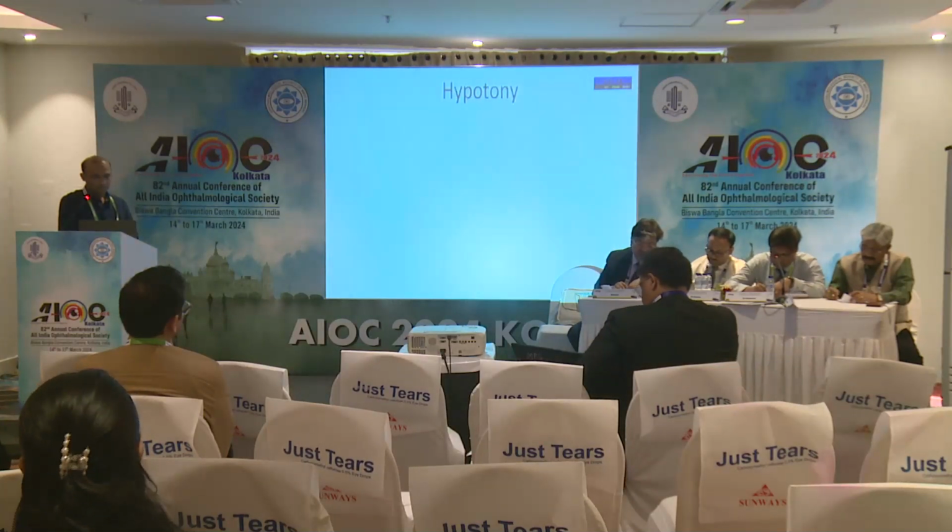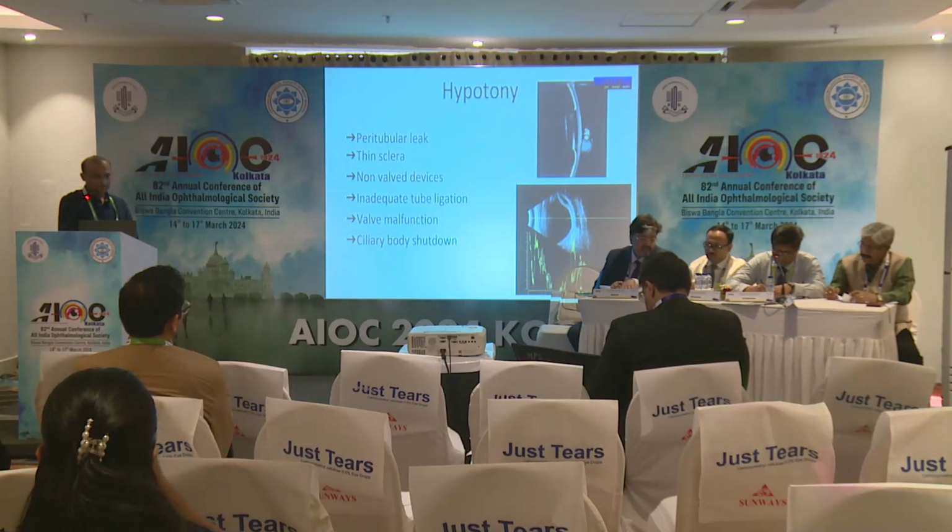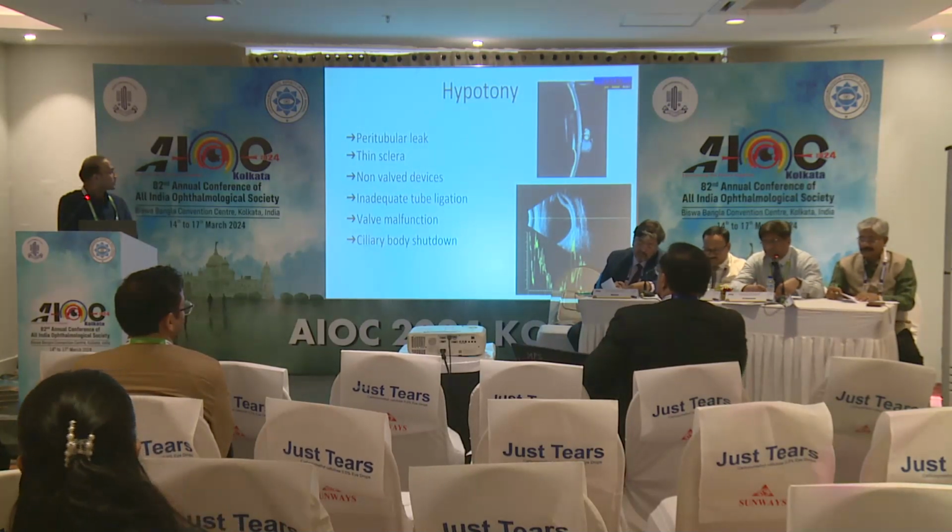Hypotony is a serious vision-threatening complication after GDDs. Meticulous attention should be paid to tube entry to avoid peritubular leaks.